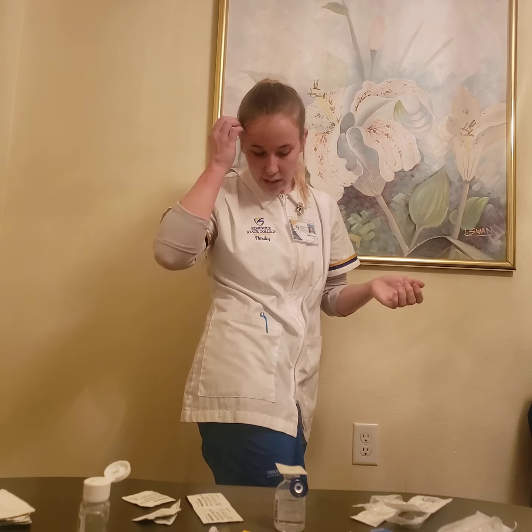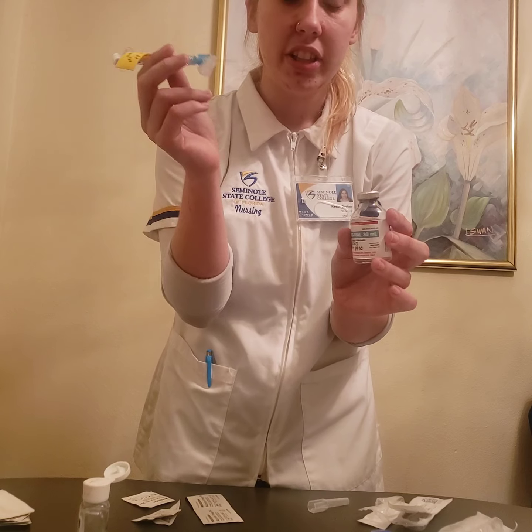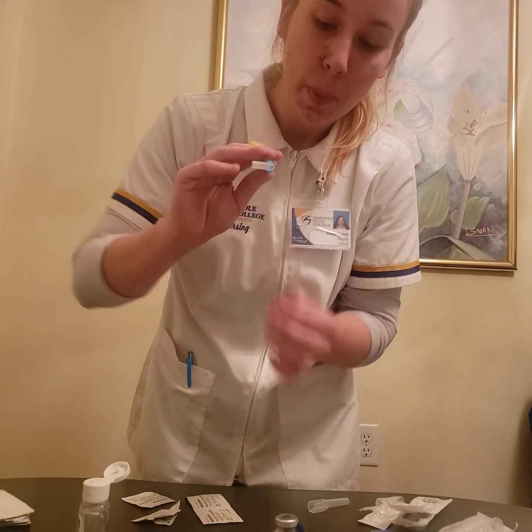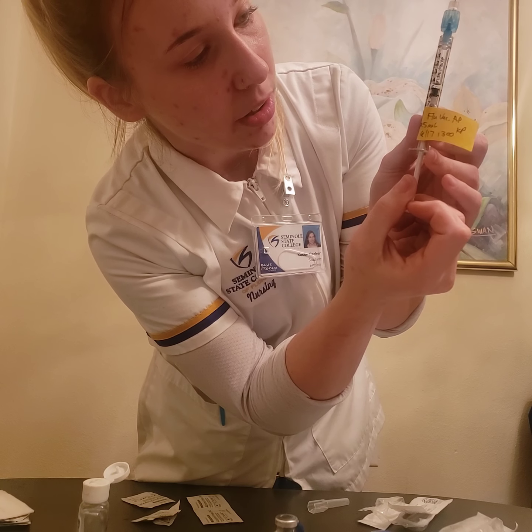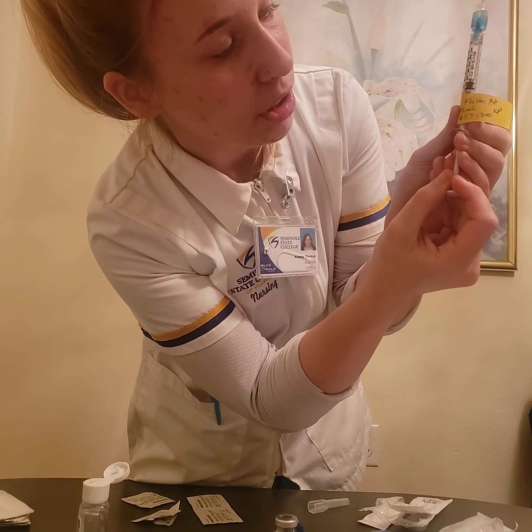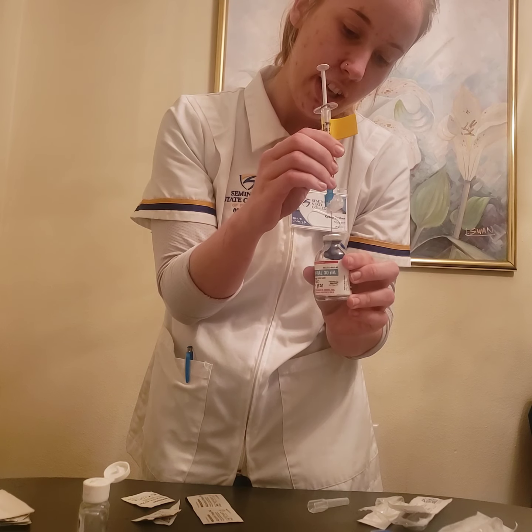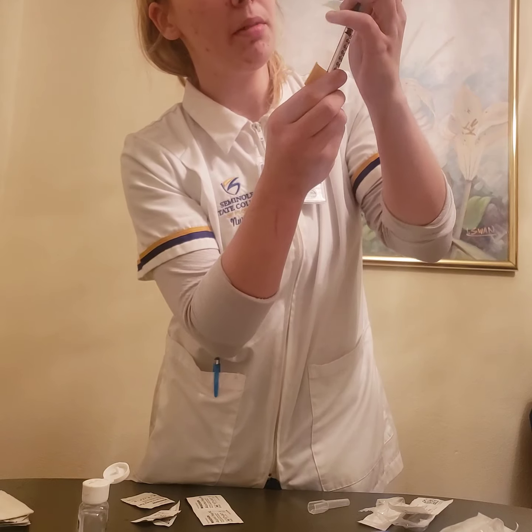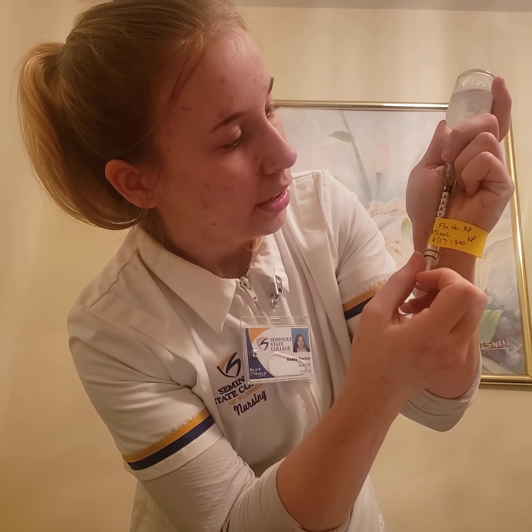Okay, so I'm going to go ahead and draw up my medication now for the flu vaccine. Oh, this would need to be air dried. Okay, so I'm going to place the needle into the middle of my stopper. Oh, sorry. So I would first be drawing back the amount of air, which is equal to the amount of medication I need to be giving, which is 0.5 milliliters. So I'm going to pull it back to 0.5. And I'm going to need to inject that air to air in the middle of the stopper. And I'm going to invert my vial, and I'm going to pull up 0.5 milliliters of the flu vaccine, trying to avoid getting any bubbles.